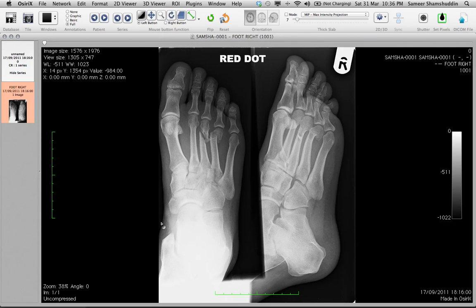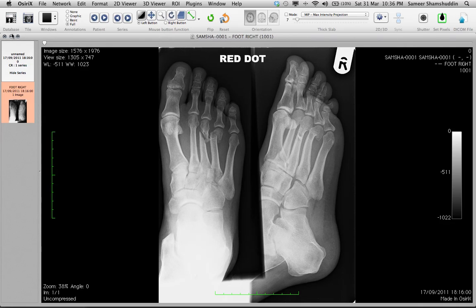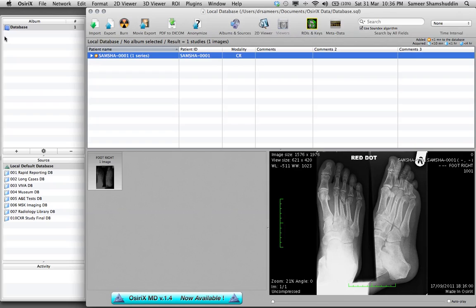If you double click this one you will see that there is absolutely no identifiable data. Even if you check the metadata you will not find patient ID, CHI number, age, sex, anything from this case. So that's the advantage of using DICOM cleaner.